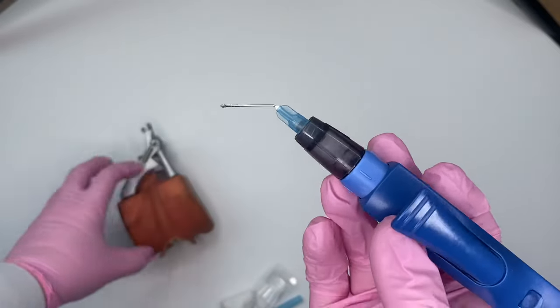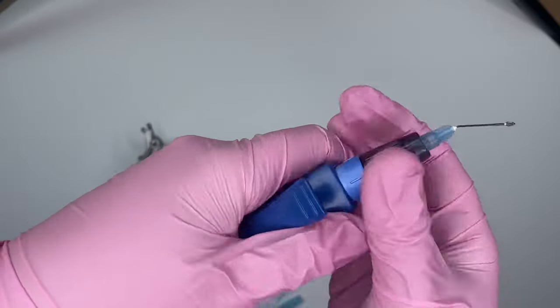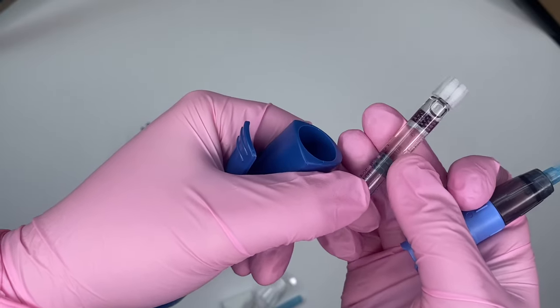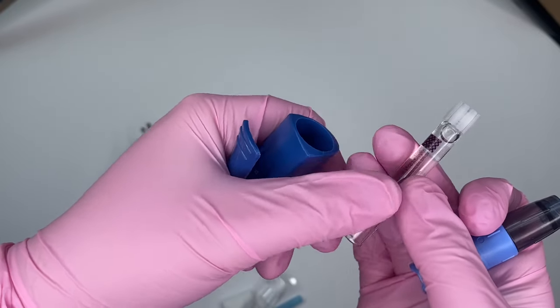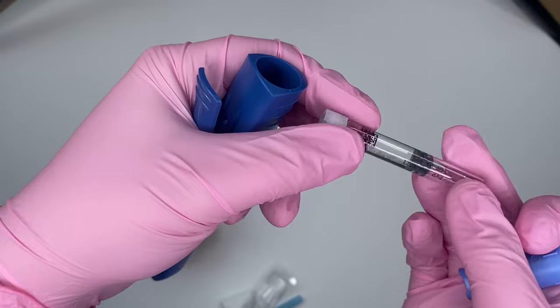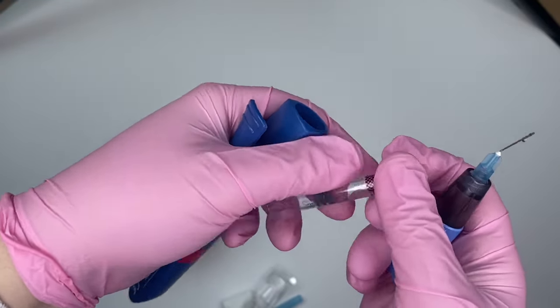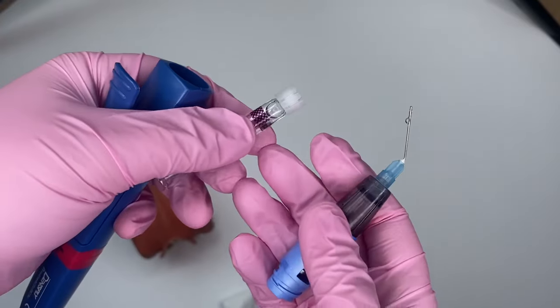Another recommendation from Dentsupply is one cartridge per quad. You end up using quite a bit, especially if they have generalized periodontal infection and it's tender while scaling. So one cartridge per patient, and again, only a couple minutes of working time.